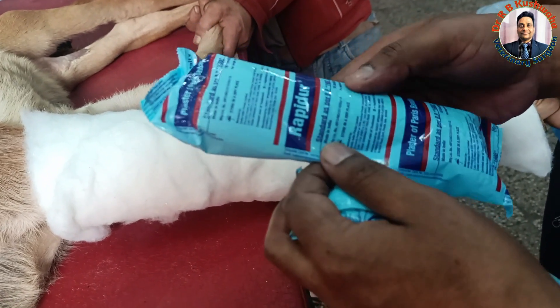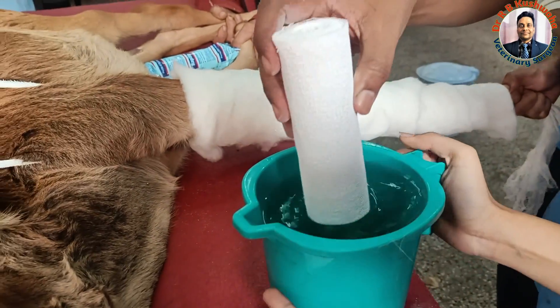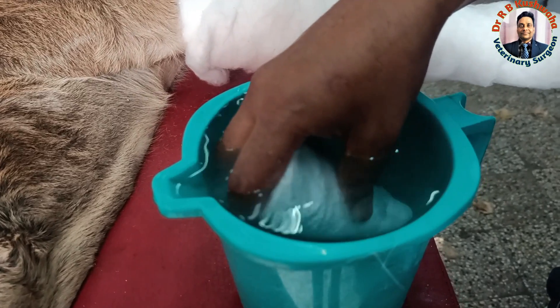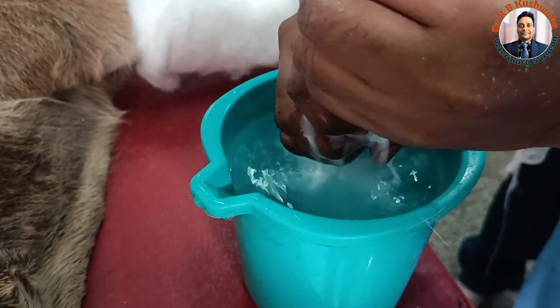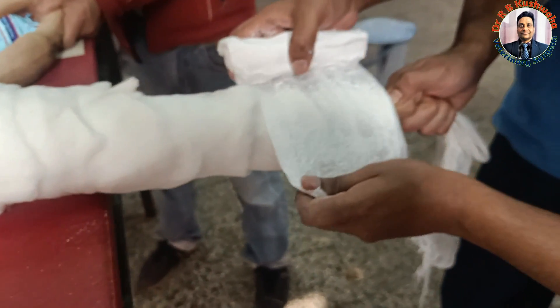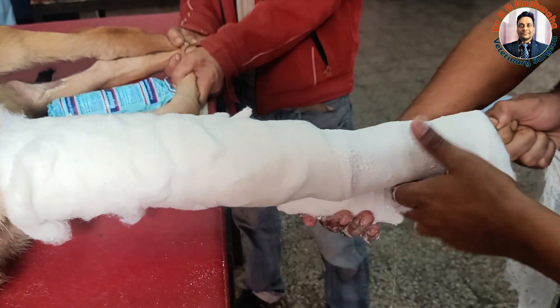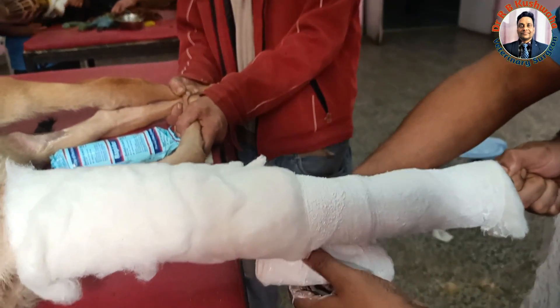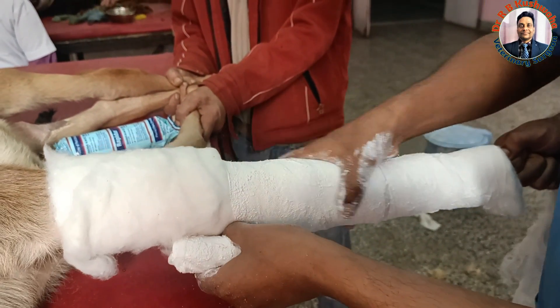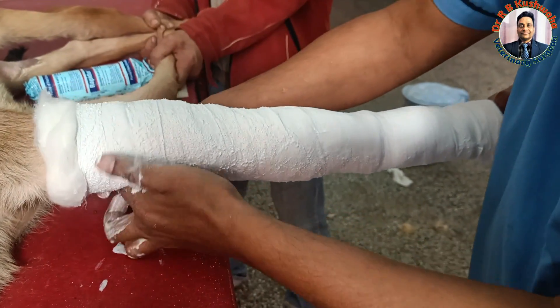We open the bandage and dip it in water — this step is very important. Once the bubbles stop, we take it out and simply squeeze it, then start applying again from the distal extremity. You can see here I am covering 50 percent of the preceding layer as I go.